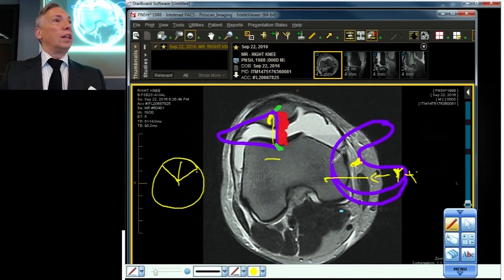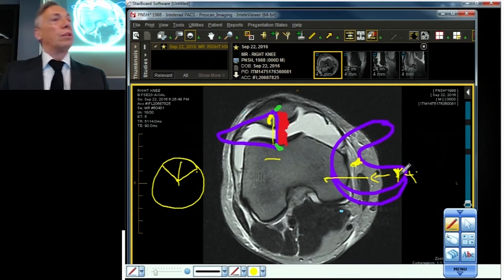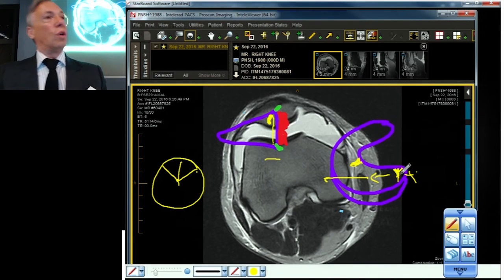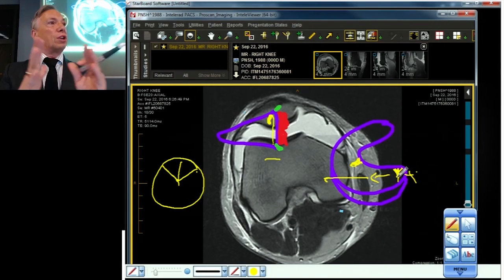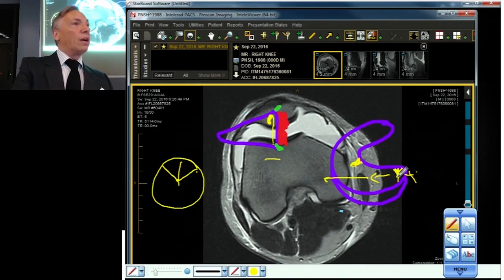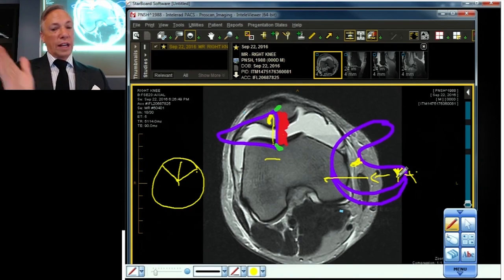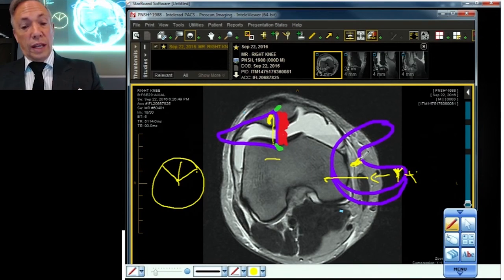The little ones, we leave all of those alone. We hardly ever touch the root radial tears that don't go all the way through. Even the ones that almost go all the way through, we don't touch. But the ones that clearly go all the way from the inner third to the outer third, the meniscus is starting to gap and separate, those we got to go after. So we've learned about two very important vertically oriented tears today. The one that's longitudinal and parallel to the outer portion of the meniscus, and the one that's perpendicular to the outer arc of the meniscus. The one that's parallel is less problematic because it's in the red zone. The one that is perpendicular is problematic.